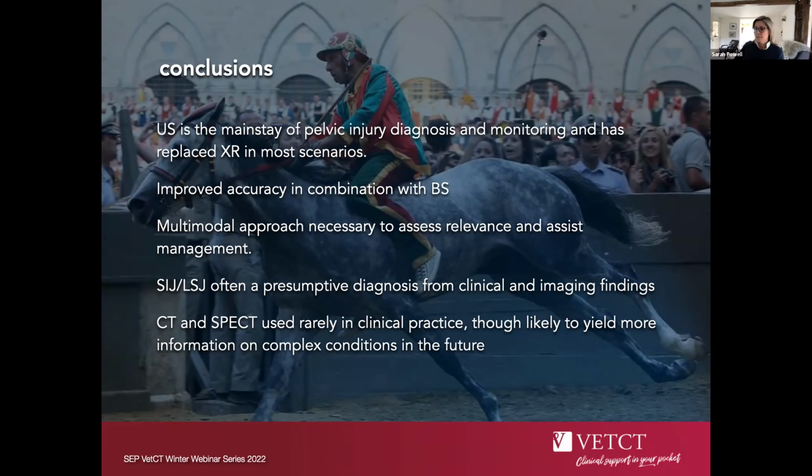CT and SPECT are rarely used in clinical practice still, and they probably will remain so for quite some time. You just can't change the physics of it to a certain degree, but likely to yield more complex information on more complex injuries going forward.